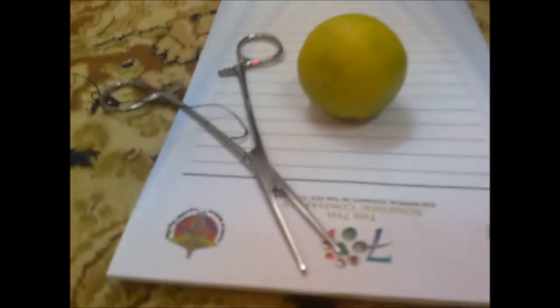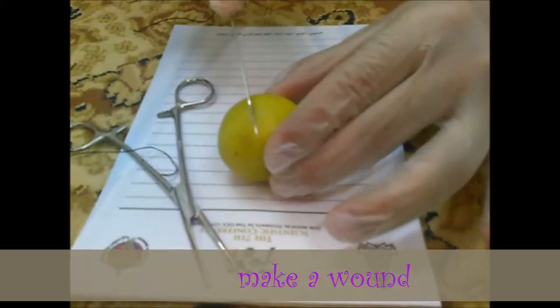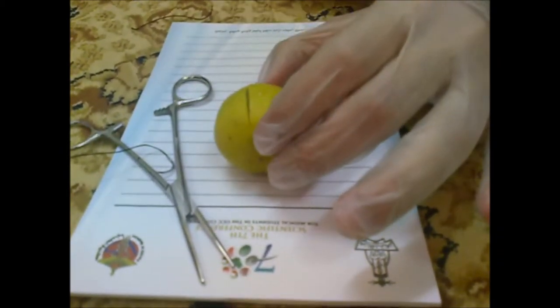First of all we have to make our wound in the patient. As you see it is bleeding now.